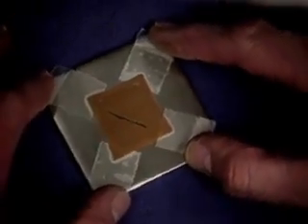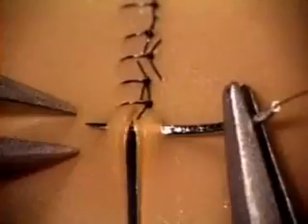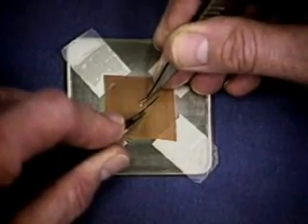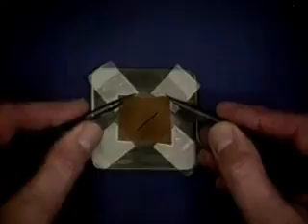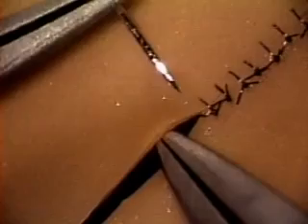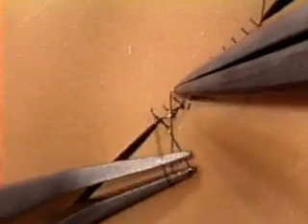Throughout this tape I've been working with the needle passing from top right to bottom left — the easiest direction for a right-handed person and the best to start with. But in clinical surgery you'll need to suture in any direction. Once you've thoroughly mastered the basic moves, turn your practice piece and learn to do good work straight up and down, straight across, and backhand — the hardest position to master. Learn to pass the needle both toward yourself and away from yourself. Lastly, practice being ambidextrous: convince your non-dominant hand it can be a successful prime mover, and your dominant hand that it can sometimes just be the helper.